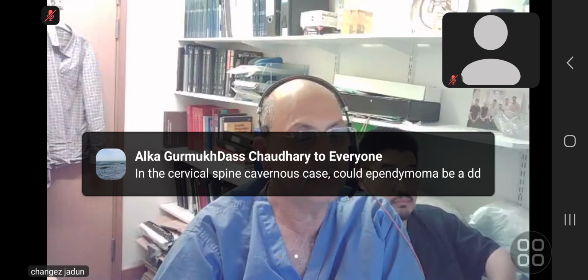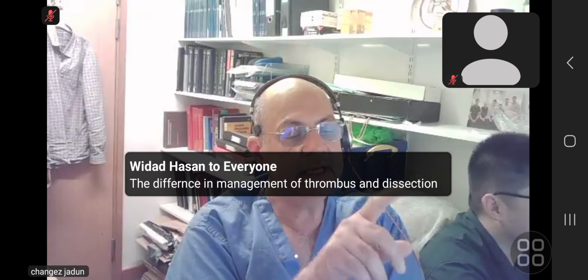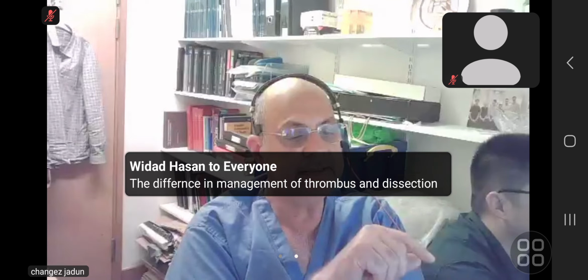How to differentiate between thrombus or dissection? Dissection has a flap, vascular lumen change, and will also have a thrombus. But there is a rat tail sign on the CTA, and a vessel wall thickening. That's the other important thing you have to remember. And it is not right at the origin like an atherosclerotic plaque. It will be in the mid body or proximal third of the ICA, sparing the origin of the ICA. That's the important take home message.